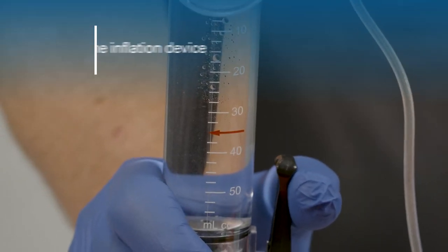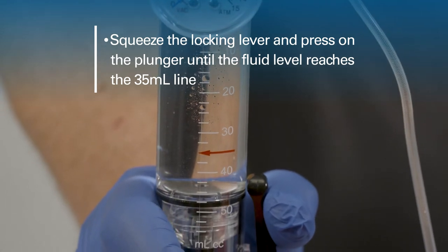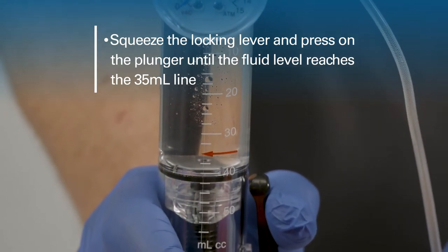Invert the inflation device. Squeeze the locking lever and press on the plunger until the fluid level reaches the 35ml line.